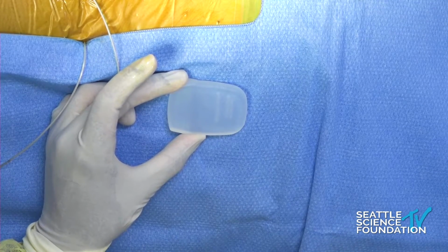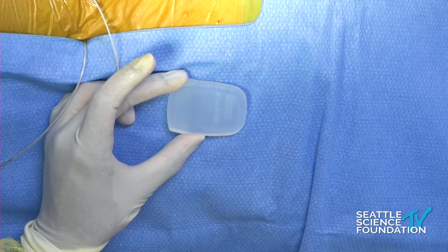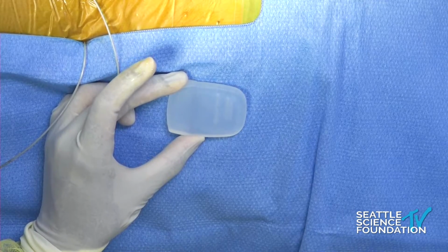The last thing you want is to put it in a place where it's uncomfortable, it causes pocket pain or whatever else. That incidence is actually anywhere, depending on the study you read, 3% to 15%, which is a real issue because you can have patients who are doing great with the therapy but hate the way their pocket feels. So really important to do all that work.